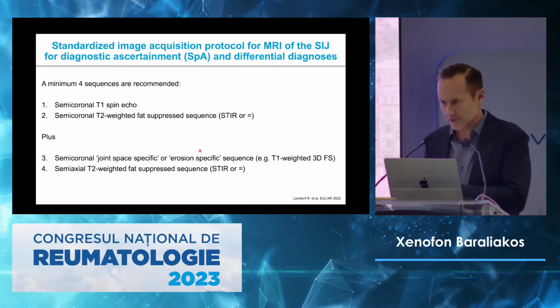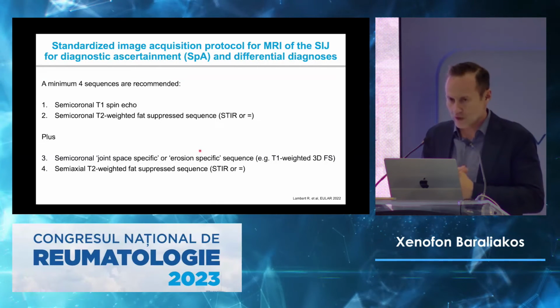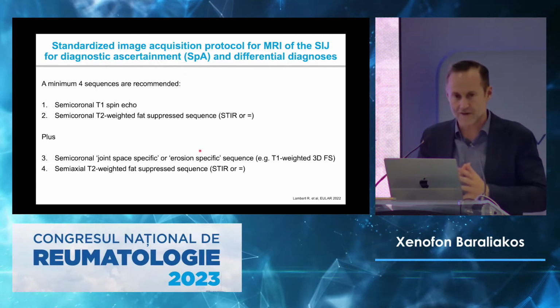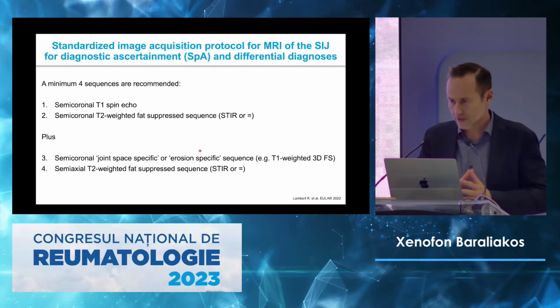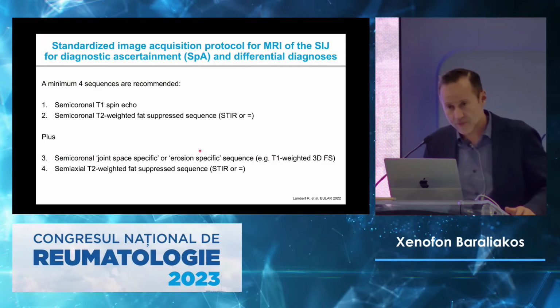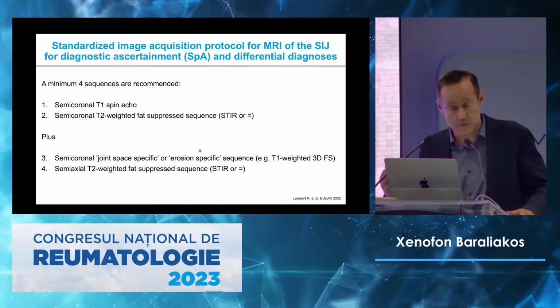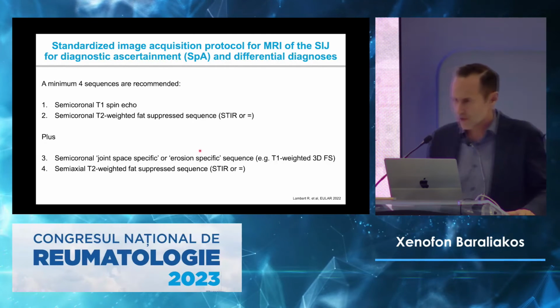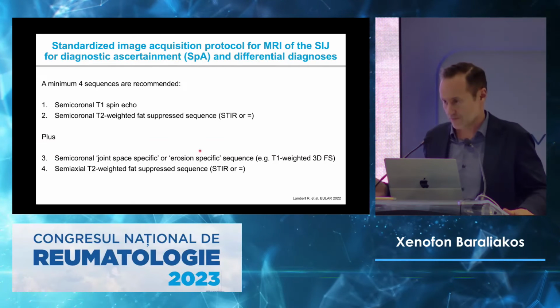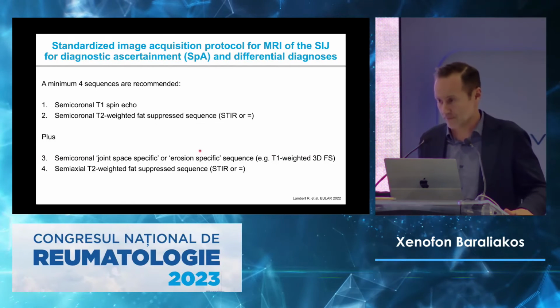In the publication you may have shown from RMD Open, what we found was that indeed, in the majority of the cases, we had inflammation in the beginning, no fat, but new syndesmophytes. However, what we do not know, and it was discussed in that paper, is that these MRIs were done every year or every second year. We do not know if there was new fat developed over time.